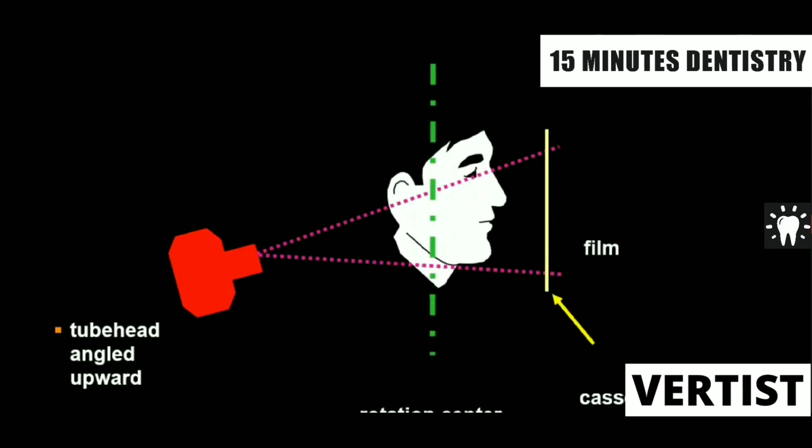Okay. So the routine conventional radiograph which you have seen, the IOPA or the external radiograph, what is that? The X-ray source, the patient, that is your object, and the film, all these are stationary. While in the tomography, there will be a rotation of the X-ray source and the film. Here the patient will be stationary and the X-ray source and tube head and the film are synchronized at the same speed, rotating around the patient.